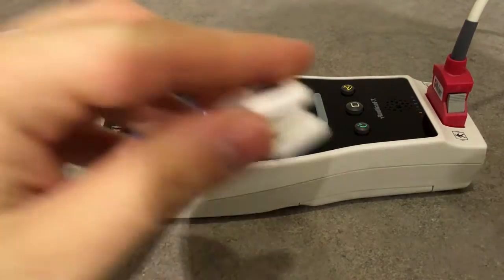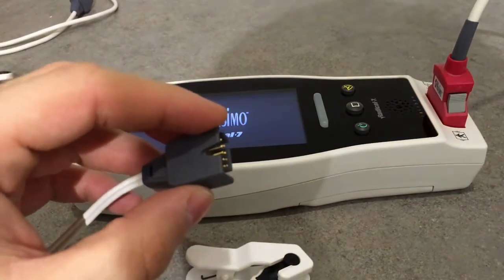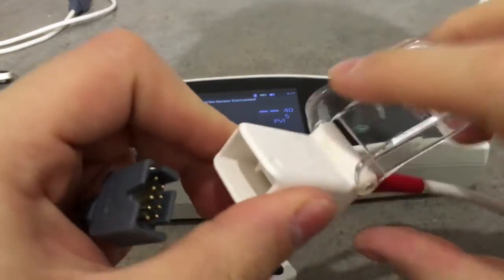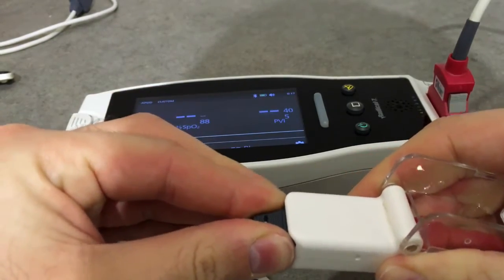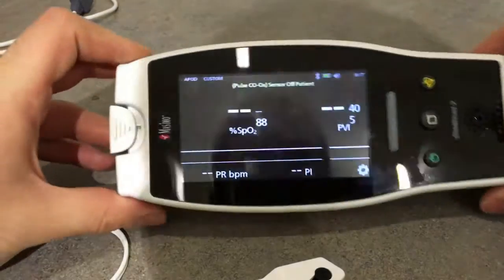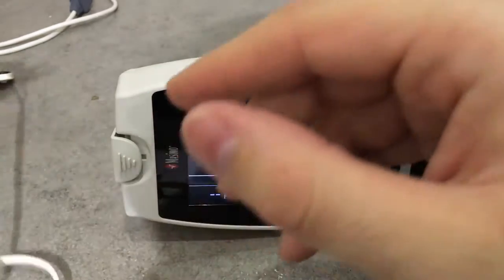We can either use a normal clip sensor or a transflectance sensor. Let's use the clip sensor now. As you can see, it now says that the sensor is off patient, so let's put it on.